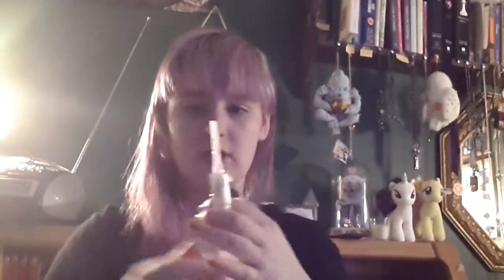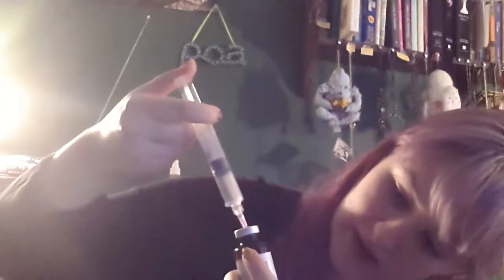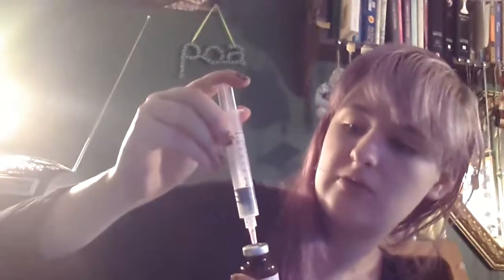Then you're going to take your syringe and pull off the protector. You're going to want to push it slightly so that a couple drops come out of the needle, and inject it at an angle into the vial. Then you're going to push it until the vial is about half full, which will probably be the entire syringe — and it is.